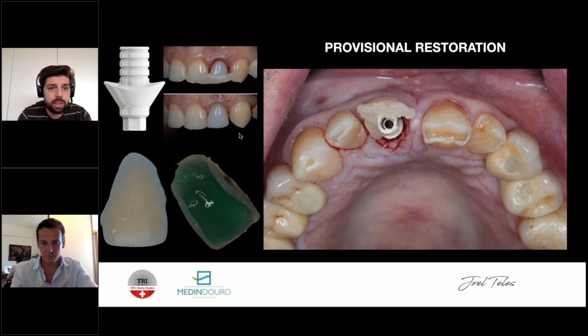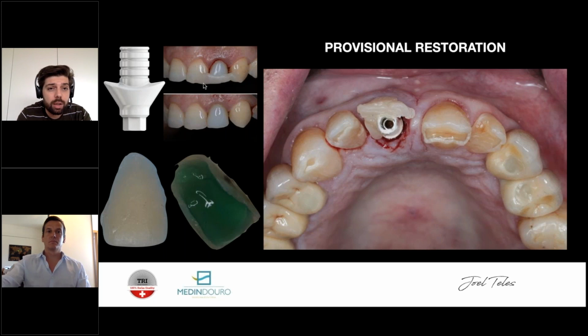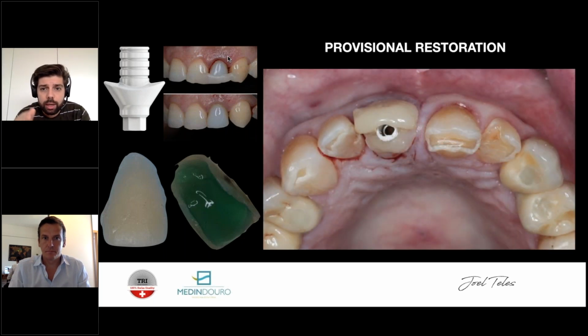And one other small tip is this jig here that I showed you in the first webinar. It's very easy to do once you're dealing with a tooth that needs to be extracted but is still there, and it allows you to always go back to the same positioning. It's as simple as this. It's a very useful tip that takes you 2 minutes to do and no money whatsoever. It's just a small amount of composite. So afterwards, you place your shell in the right positioning, and you add composite sealing the socket on the posterior region, exactly like you do when you're creating an individualized healing abutment. It's exactly the same principle.